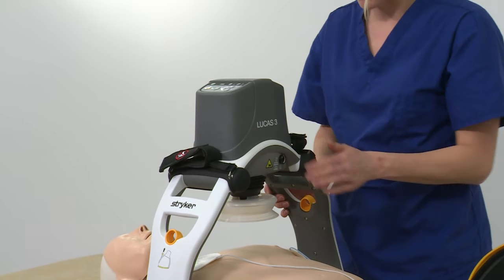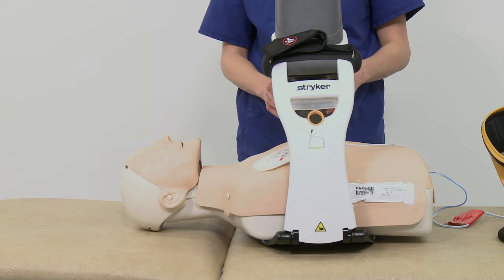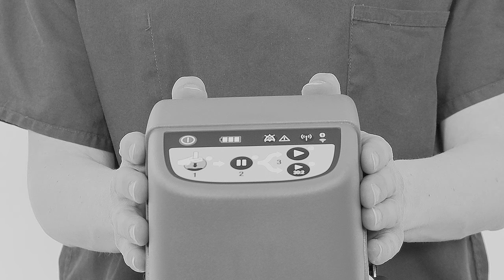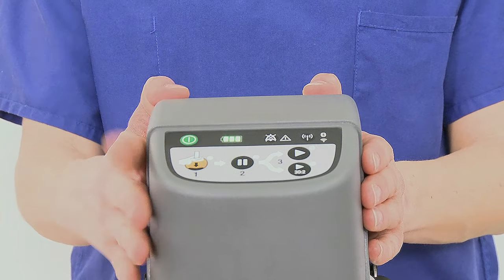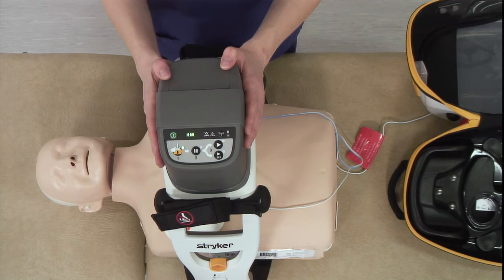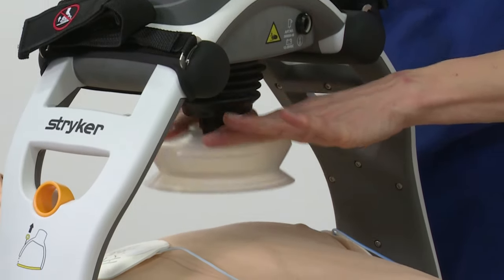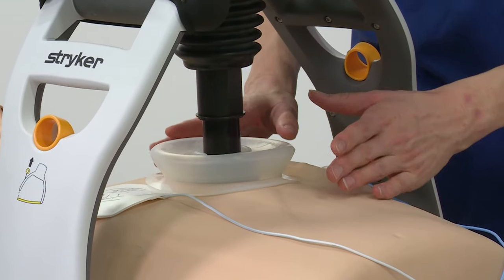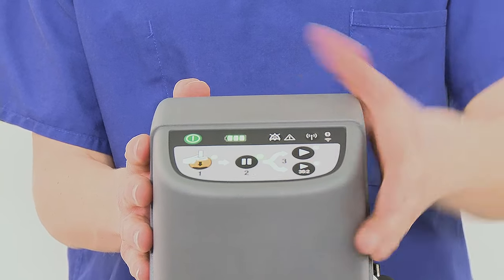Make sure the lower edge of the suction cup is immediately above the end of the sternum. If necessary, move the device to adjust the position of the backboard. To turn the machine on, press and hold the on/off button. To set the suction cup, pull it down to touch the patient's chest, then push the pause button and the device will lock into the correct start position.